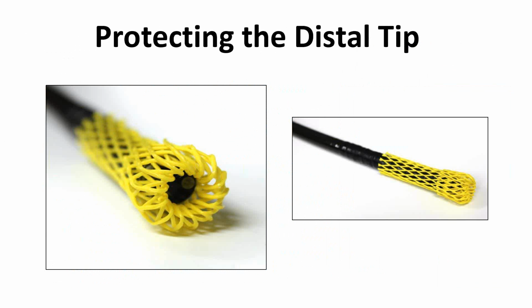So there are different products that are available. This one in particular, it's not a spongy material, so it won't remain wet if there's any moisture there to begin with. So it will help facilitate the drying and allow for airflow through the channels while protecting your endoscope. Next slide.